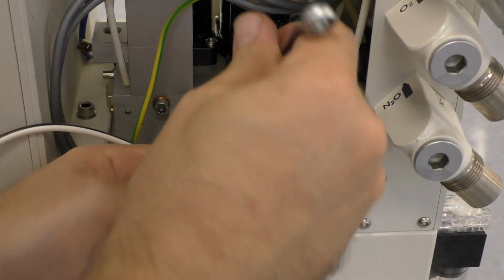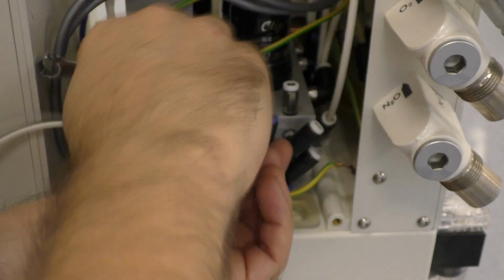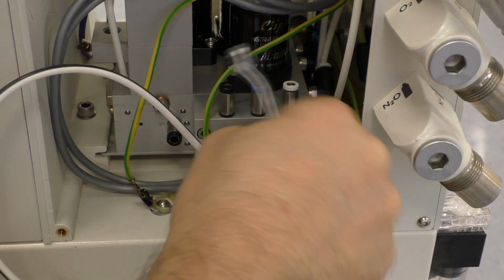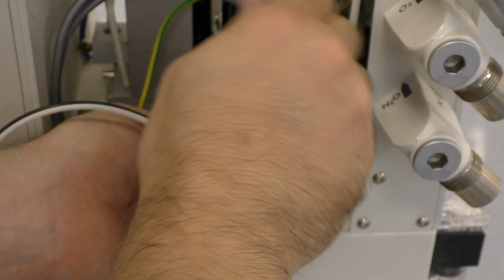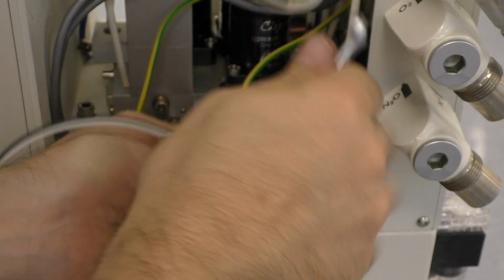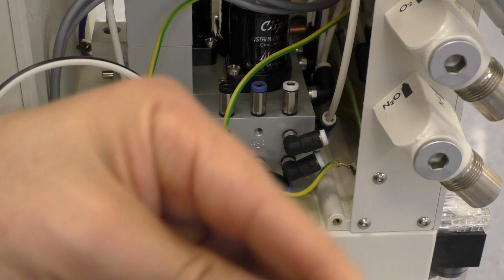I really like these small hose connectors. They are so clever and they are easy like Lego. You can turn them in either direction. This is a rotary seal here. Even under pressure you can move them around if you want. And you just have to unscrew this, and because it's a moving part here, you can also screw it in.